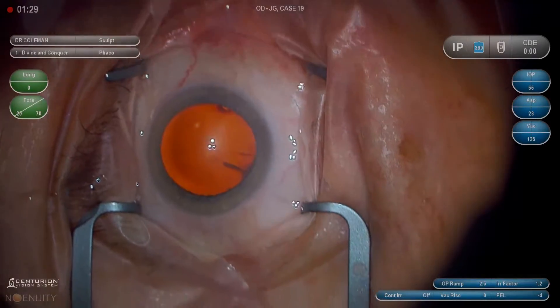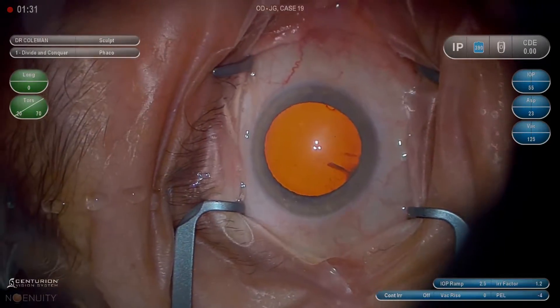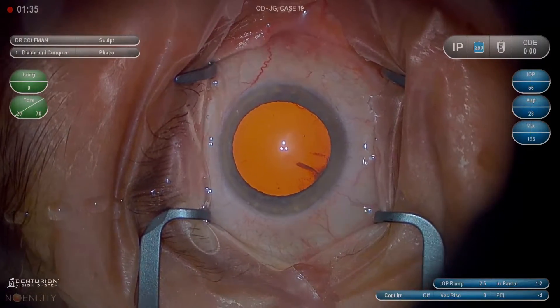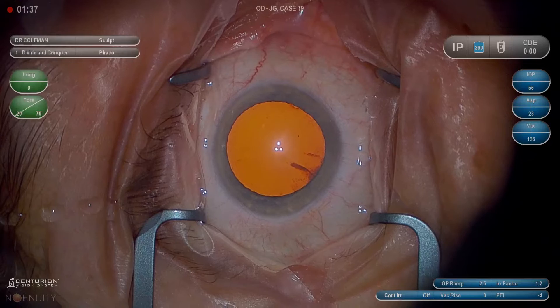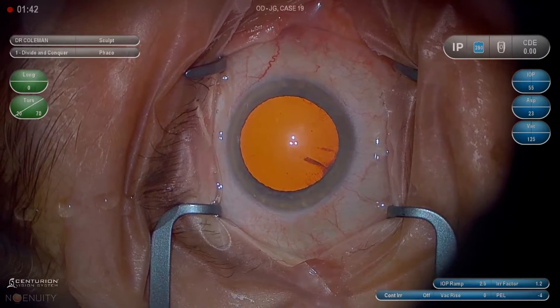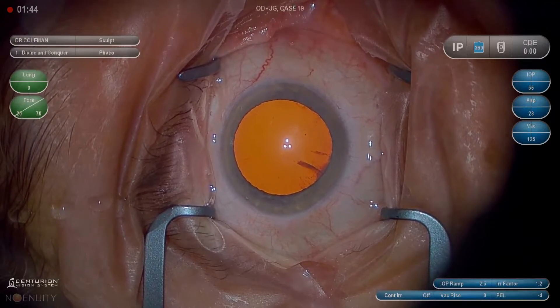This is Dr. Weich Coleman. This video is intended to be a cataract fundamentals video. There are many videos on the web that show advanced techniques, but this one is directed specifically for residents and fellows who are perfecting their technique and need to get down the basics. So it's unedited. We want to talk through every step if possible.